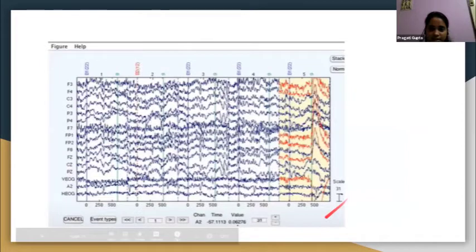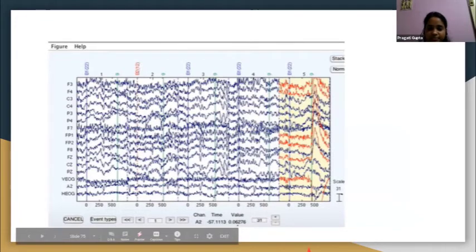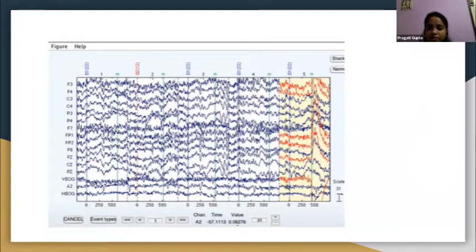And you can see these areas which are marked in red. These areas will be rejected, and these are the artifact detection parameters we have seen. These channels and epochs will be rejected because they are artifacts, eye artifacts from eye movement, because eye blinks also act as a dipole, which creates a very high artifact in the frontal channels, and sometimes in the later occipital areas also.